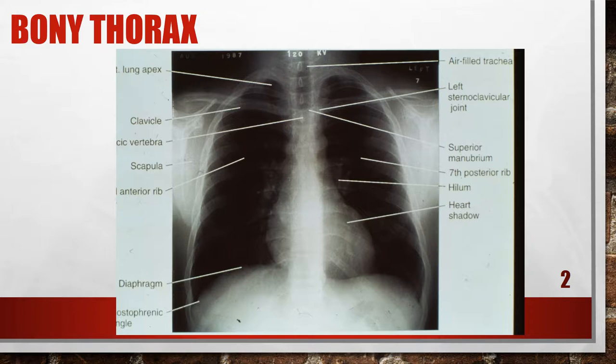I want to make sure I have a little bit of the air-filled trachea. If I'm taking a picture of a pediatric child, I would want more air-filled trachea. I want to make sure there's a little bit of the apices above the clavicle, the costophrenic angles are on, the scapula are pulled away from the chest field, and the heart shadow is properly aligned and not obliqued. I definitely want to take a look at my sternoclavicular joints to make sure they are even on either side of the vertebral column.